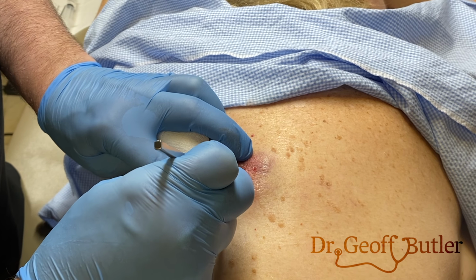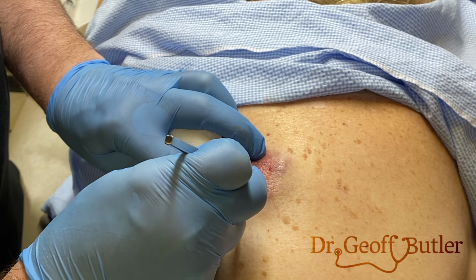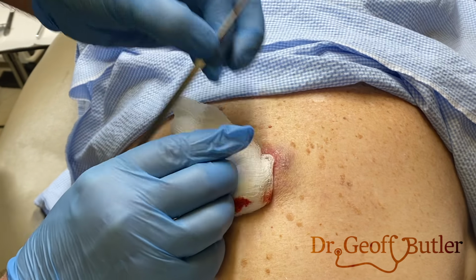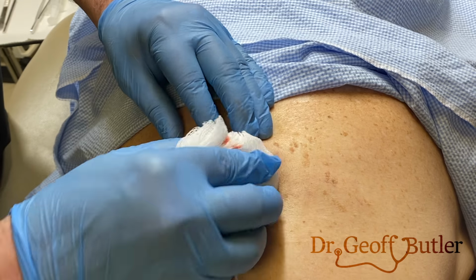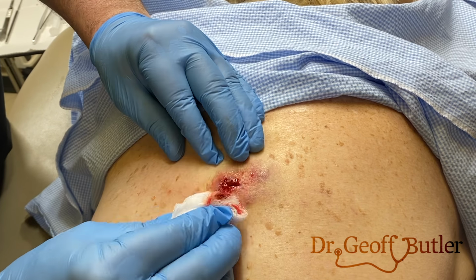So this is always a balance, because anesthetic's not fantastic here. Yeah, and that's why I don't want to do a lot of it. Now you can alternatively, some people will use a Q-tip, and you can do that as well, but really if the area is not anesthetized, it's going to be sensitive no matter what happens.